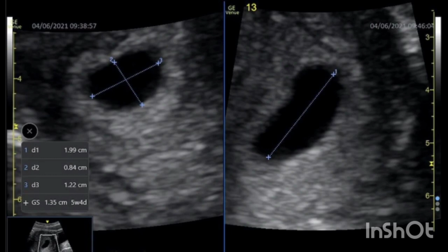In other words, the gestational age of the embryo is determined by measuring the mean diameter of the sac, as measured from inside wall to inside wall of the sac. If the gestational sac is not completely round, then it may be measured using three orthogonal distances from the inside of the sac, using sagittal and transverse views. The mean sac diameter is then either compared to a table of values, input into a regression model, or input into the ultrasound machine, determining the estimated age through preset calculators on an obstetric setting.